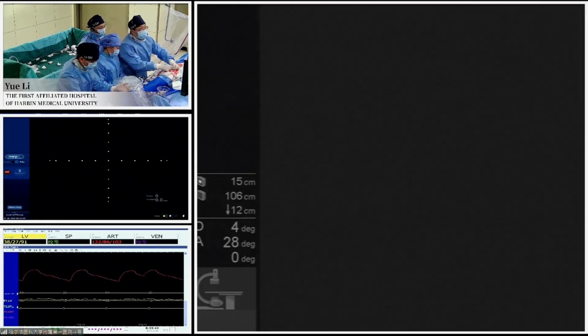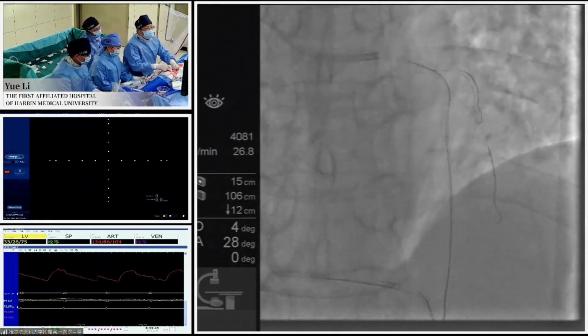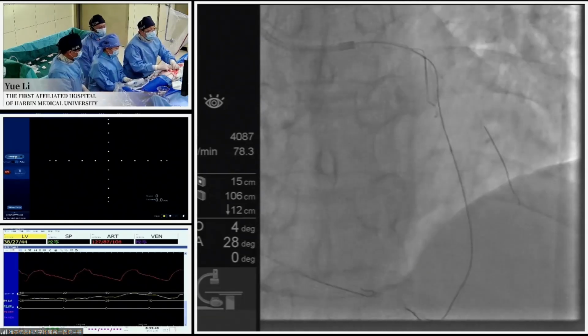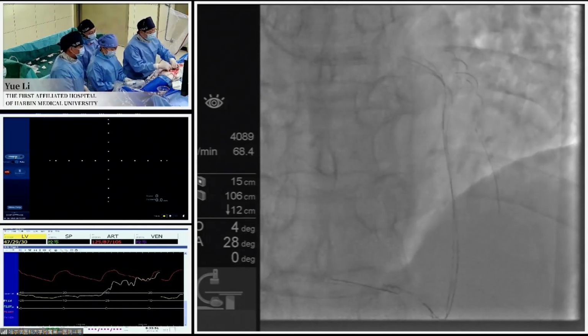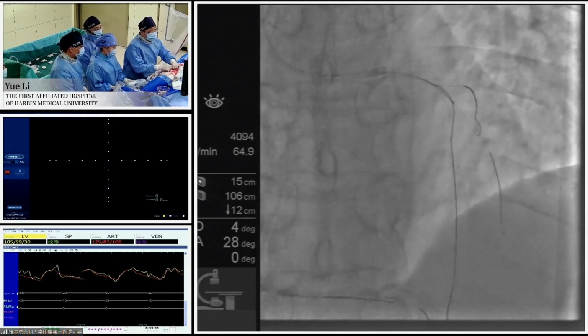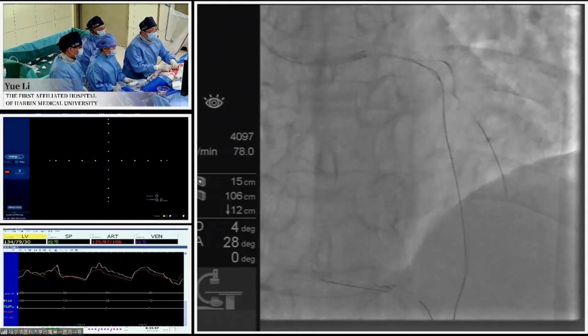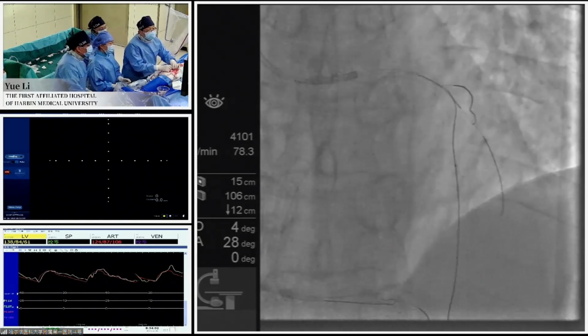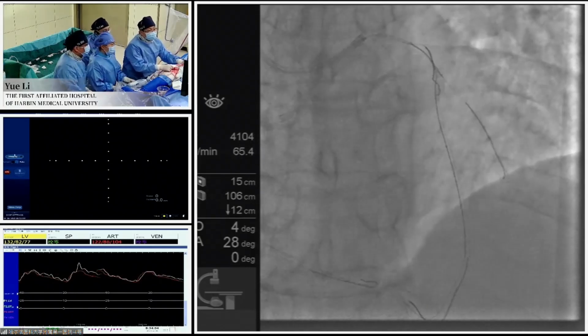Although, as Professor Li just mentioned, the CT angiography reconstruction suggests a J-CTO score of 1 to 2, we can see from the antegrade approach that there are still a lot of problems we met, because this one is a little unique and a bit difficult to advance.